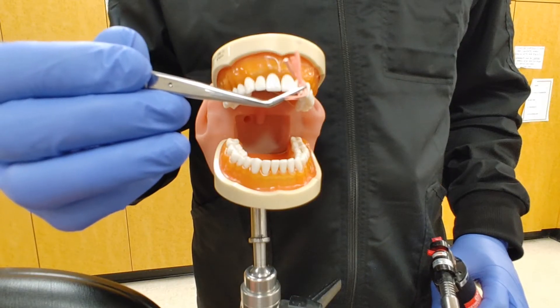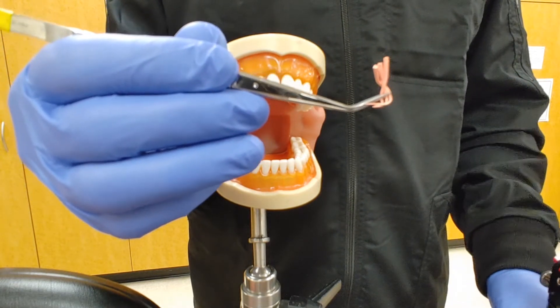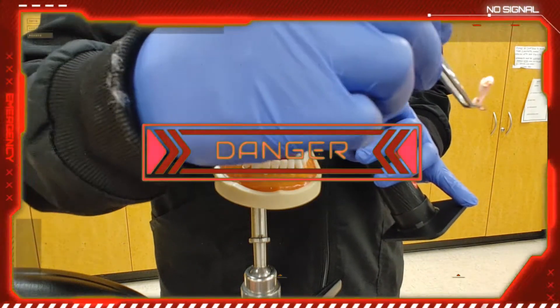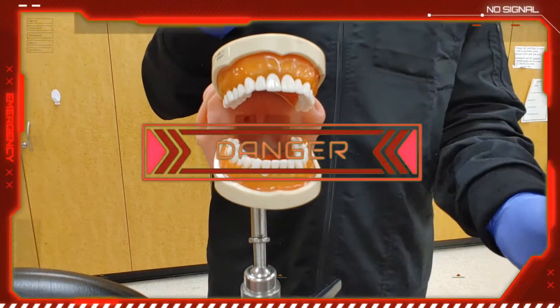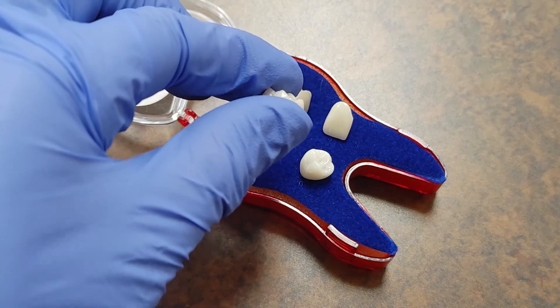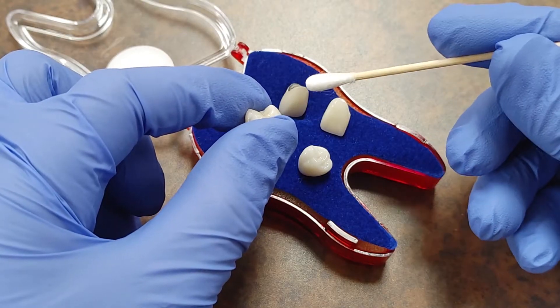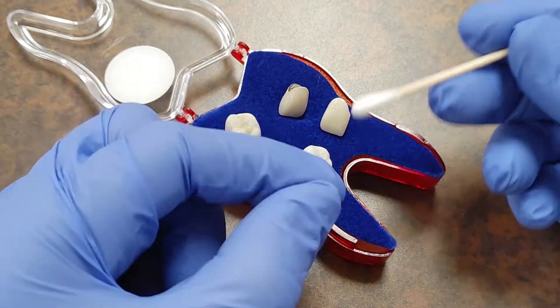This next method, the heat test, is one of the least used ones, but if we do have to use it, we tend to use a thick piece of gutta-percha that will melt down and apply to the tooth with the same type of response. Just be sure that you don't catch fire to the gutta-percha and set off the smoke alarms. Also be careful when vitality testing teeth with crowns, because the thickness or the material the crown is made out of means the stimuli cannot pass into the nerve of the tooth to get an accurate response.